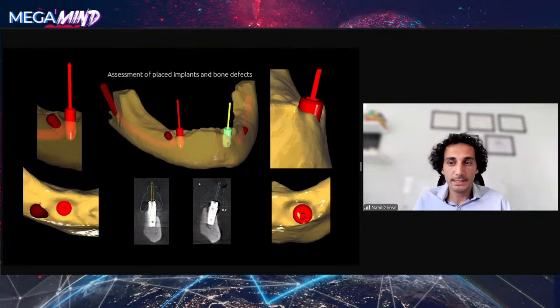As we see, the implant placed inside 33 presents a bone defect, but its position is a little bit outside the bone envelope, making bone grafting in this region inadvisable. So it was decided to keep it, but to disinfect it and polish the buccal surface of the implant. But for the other implant, it had a contained defect where we could potentially gain some bone if we graft the site.